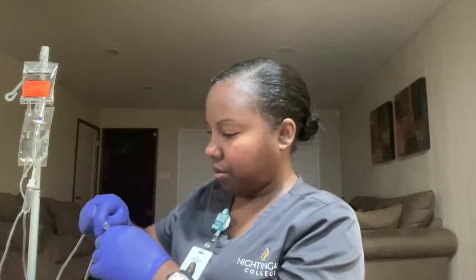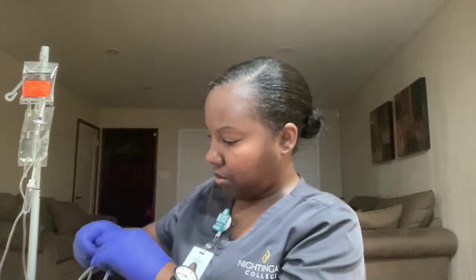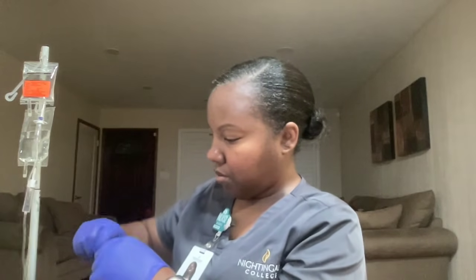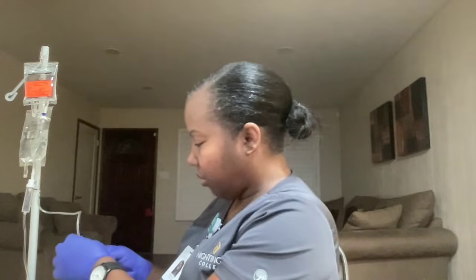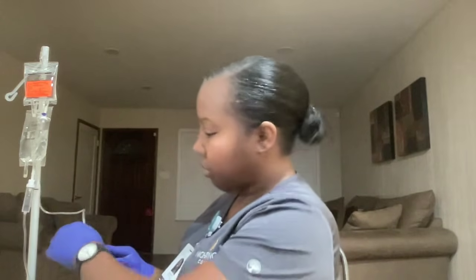And then we'll connect the two. Okay, now as you recall, for the amoxicillin, it's going to be 100 drops per minute. So again, we're going to time this.